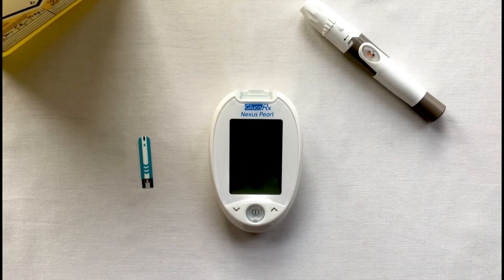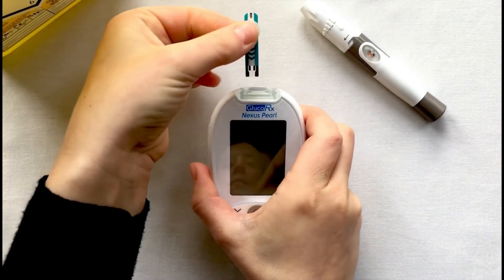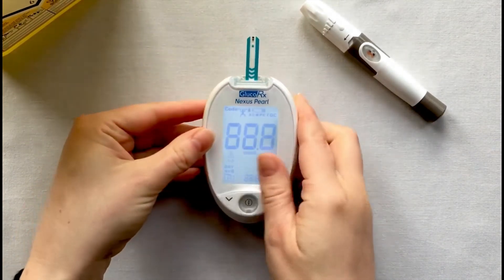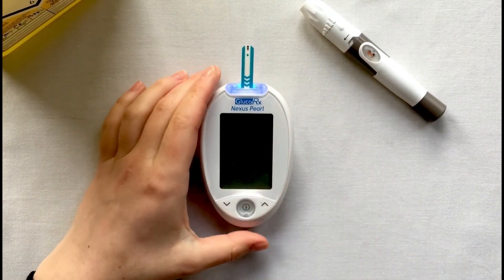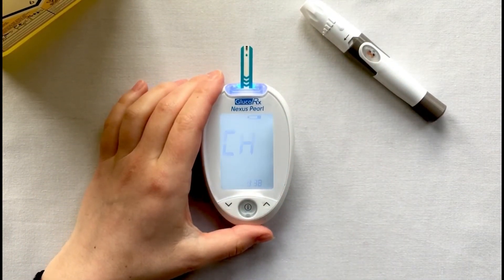Insert your strip into the top of the meter ensuring that arrows are pointing towards the meter. Once the meter is ready to perform a test you will see a flashing blood sample at the top of the screen.